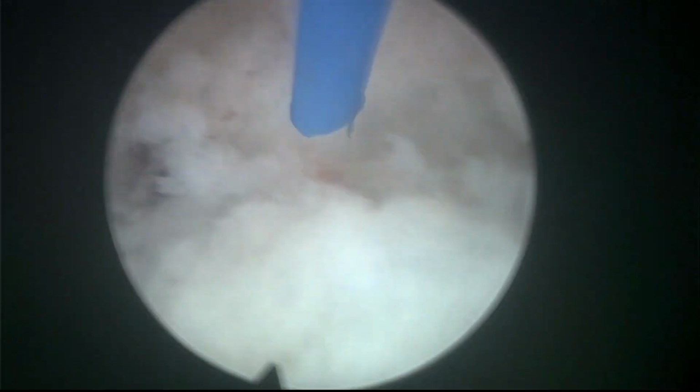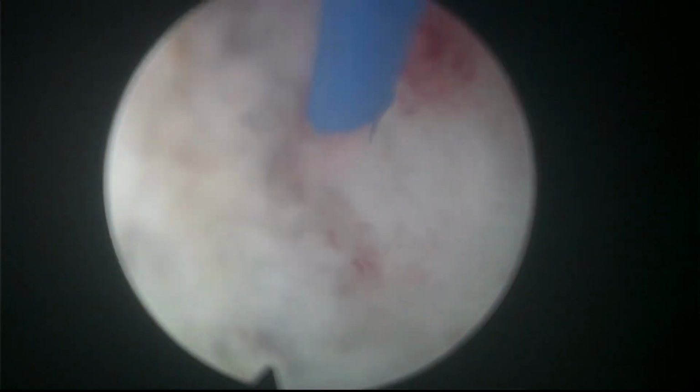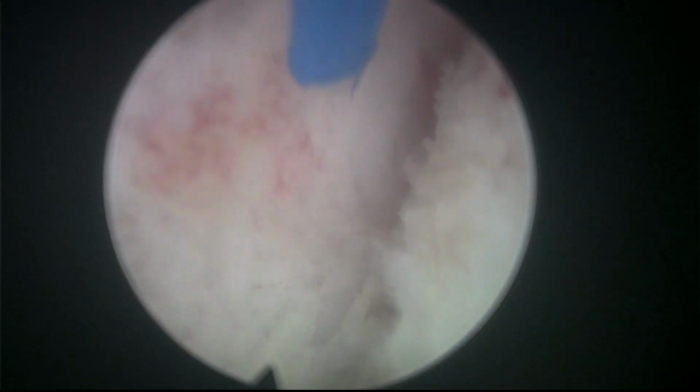You don't have to rotate the scope. You don't have to keep the camera. You just hold the instrument as you would hold a pistol. If you're going to fire a pistol, you fire keeping the bullet outlet at 12 o'clock. And this is more or less the idea.